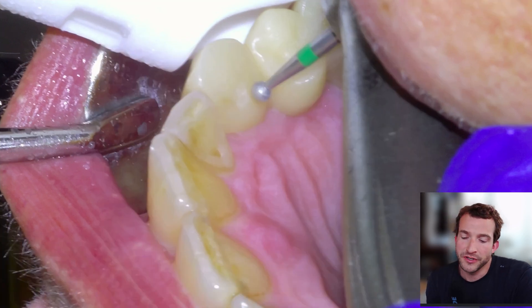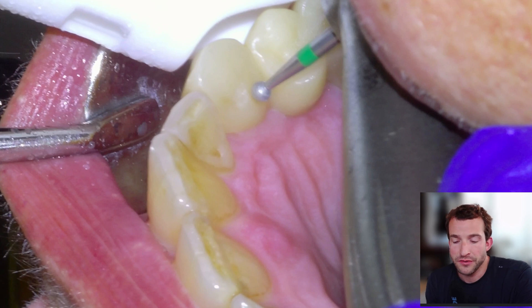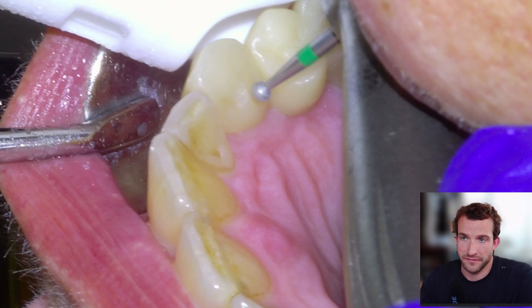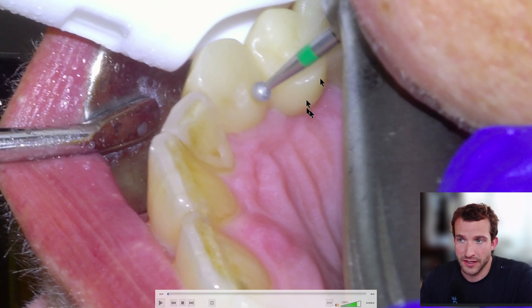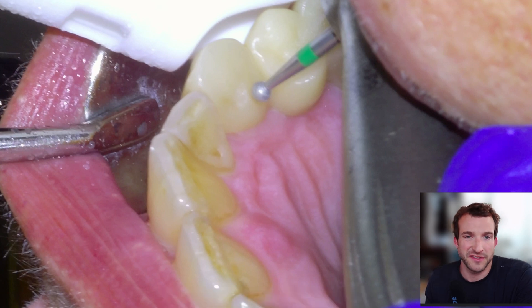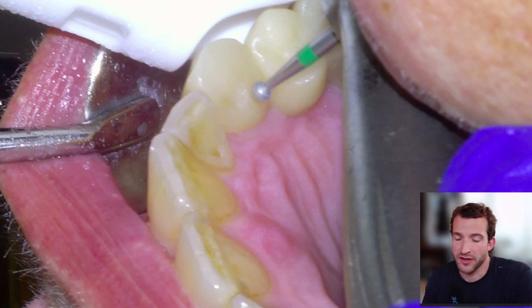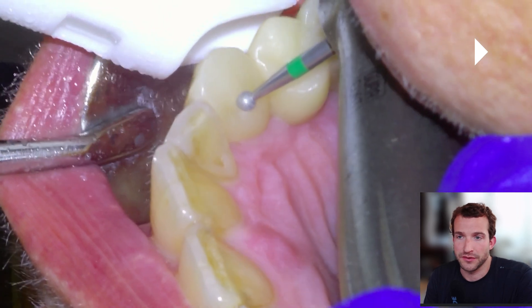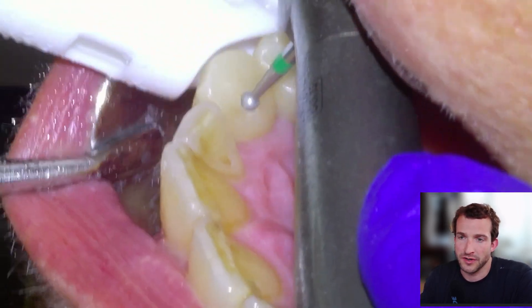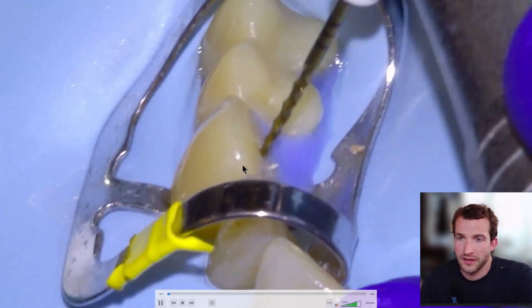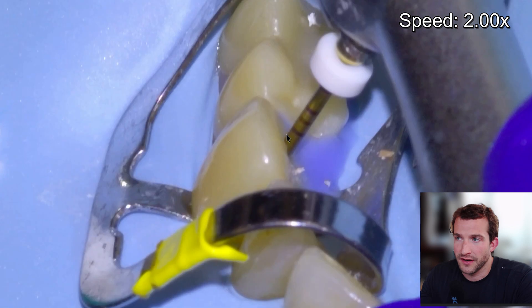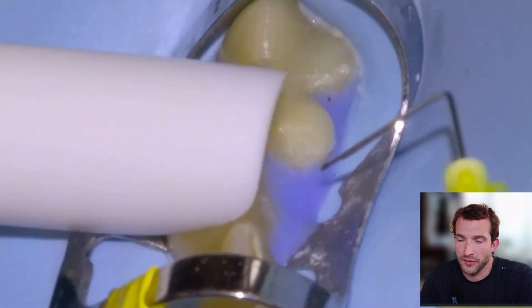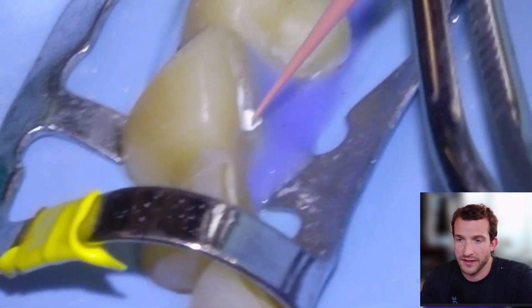Hey guys, Dr. Dobson. I'm going to be doing endo through a bridge on a canine tooth. This was a full contour zirconia bridge that I did actually a couple years ago. The patient called and said something just felt different, a little bit of tenderness to bite down on. So here's the case. We're just going to do our access and standard endo, and then we'll get into the workup of the case.